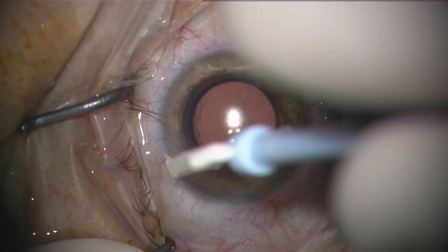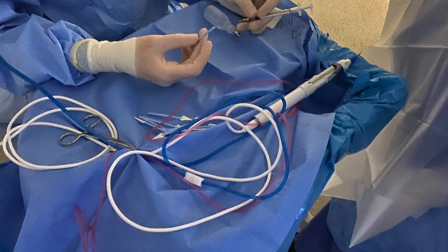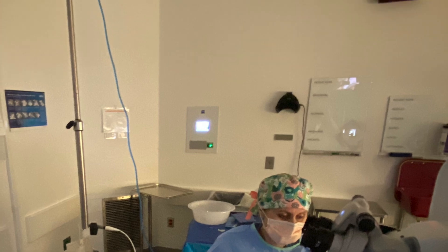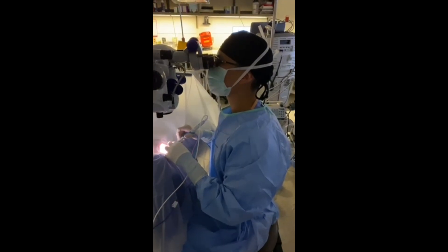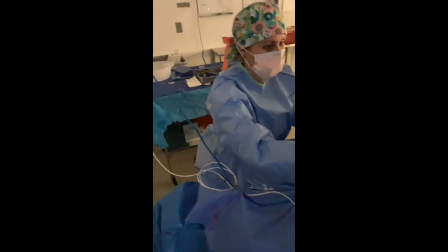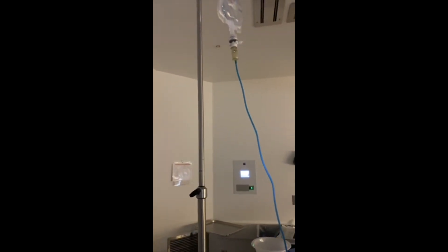I'm going to show you some pictures now of the actual device. That's the handpiece, those are all the various cords, and that's the fluid bag that just hangs up there. Here you can see me actually operating. That's the device — I'm sure it'll get better and better with time, and that was just my one experience with it so far.